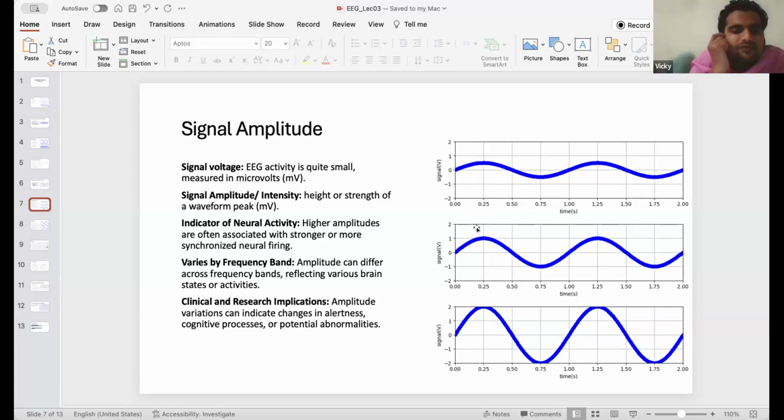Ma'am, so the frequency bands, like gamma, beta, alpha, delta, we can also talk about them in terms of amplitude and frequency. Like if the frequency is lowest and amplitude is highest, that means delta. It's generally seen like that, and it follows something called a power law. Higher the frequency, lower the amplitude; lower the frequency, higher the amplitude. We see that, but there are exceptions. There are peaks and some other behavior.